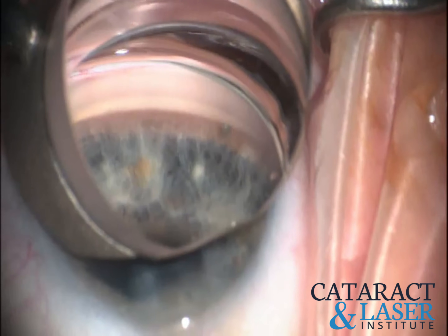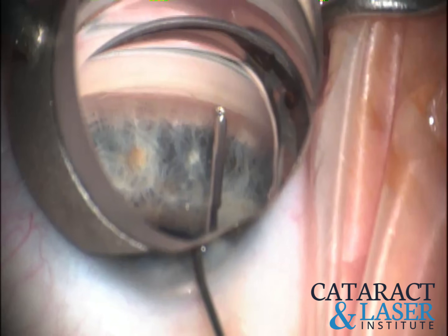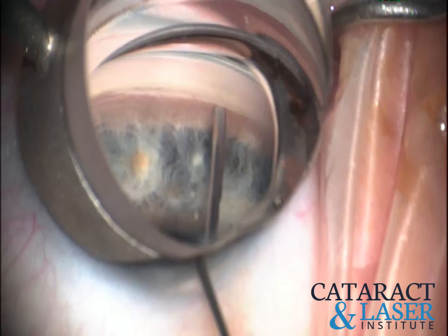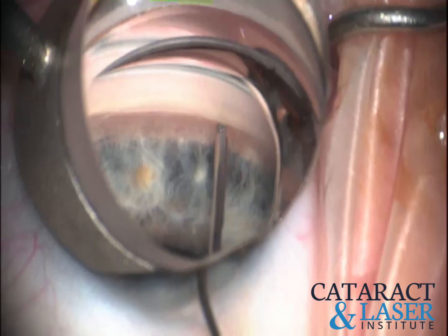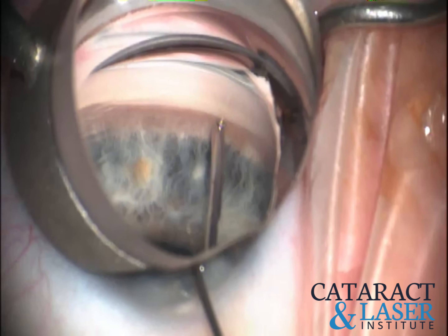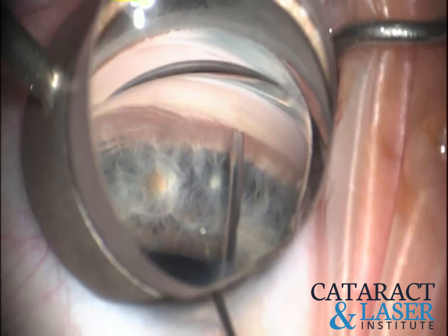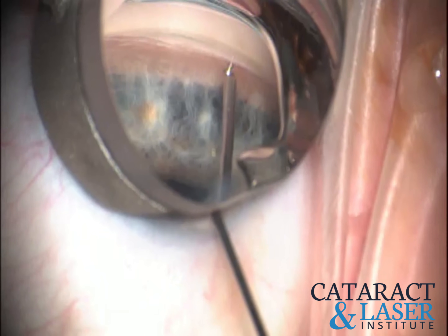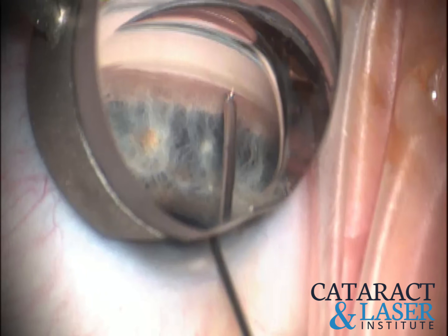So I'm going to go back in with my viscoelastic cannula. That way if there's any bleeding when I'm messing around with the stent, I have the ability to move it around and clear my view. You can see clearly that that inject is not completely in. The viscoelastic cannula tip is actually the perfect size to work with these inject wide — we're just going to push this thing right up towards the TM and replace it entirely.